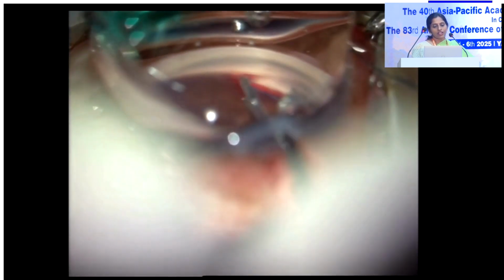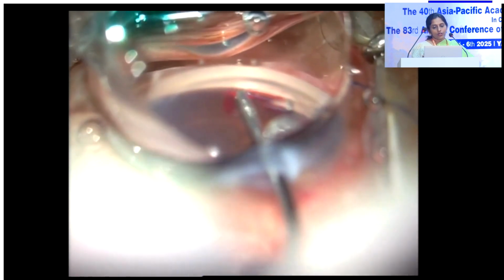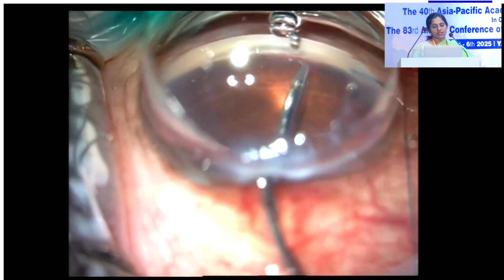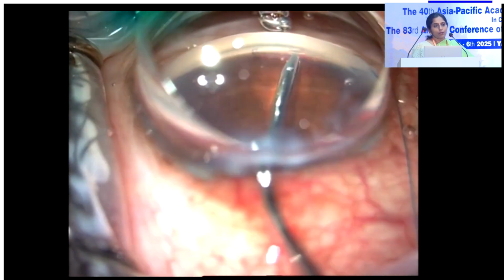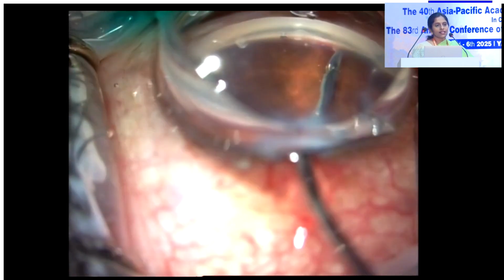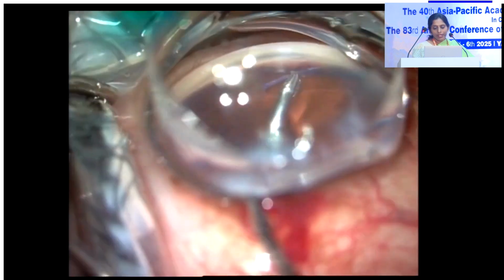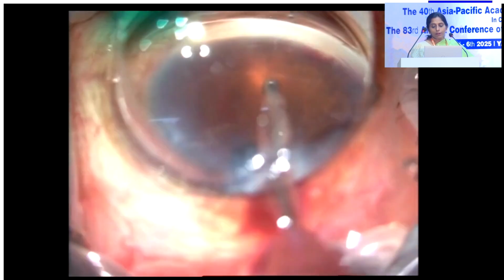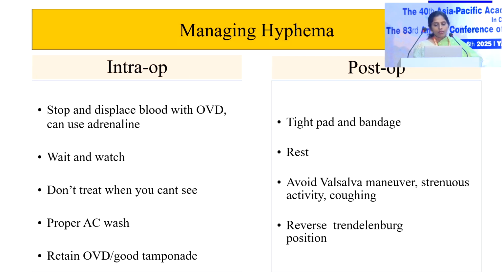Secondly, you may be just having a false passage, and that might also cause more complications, like you can have iridodialysis, you can have bleeding, cyclodialysis, etc. Compared to the other surgeries like Trabectome, minimally invasive glaucoma surgery, or the KDB Glide, the GATT is supposed to have a lot of bleeding because you're basically creating a 360 degrees trabeculotomy. So there may be bleeding points which occur circumferentially, producing a profuse bleed. So managing hyphema, how do we avoid hyphema, or how do we control the bleed intraoperatively.